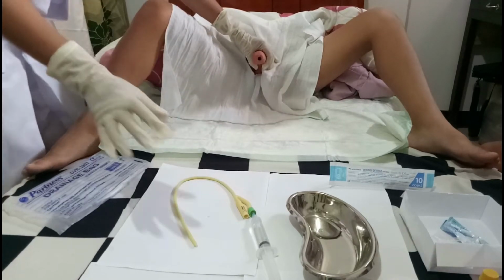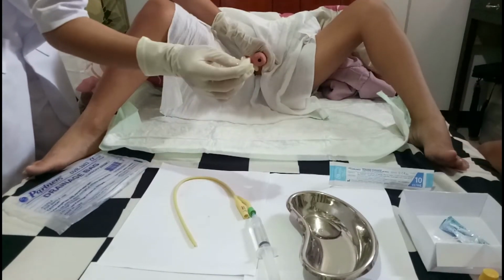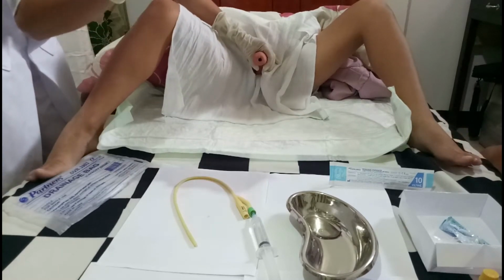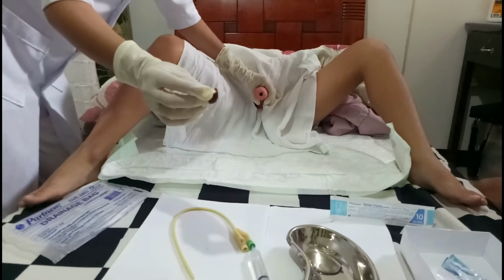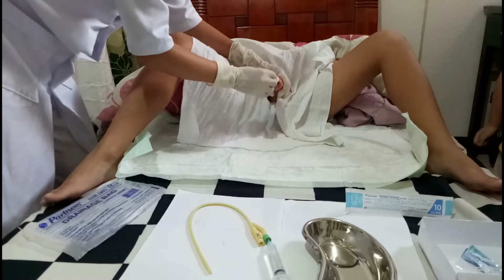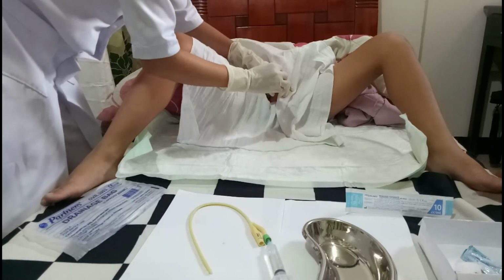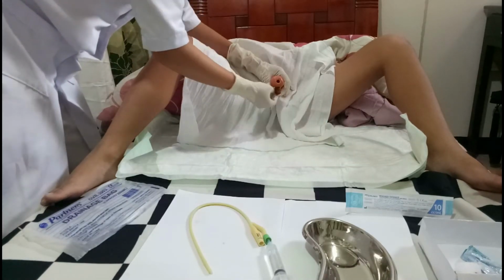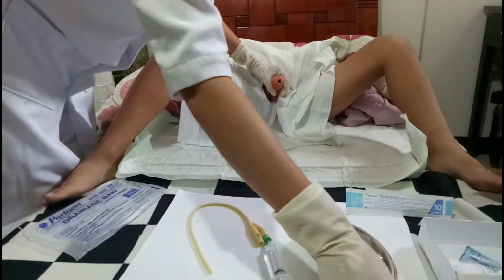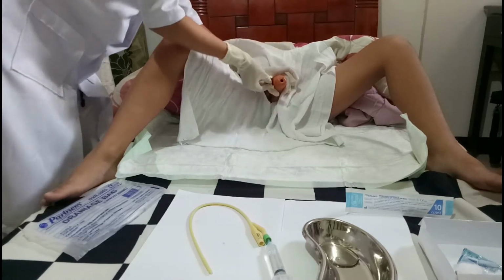So I'm just going to clean it now using my sterile dominant hand and with these cotton balls with betadine solution. So first I'm going to clean the inner to outer portion, then discard. Next, from inner to outer portion, then discard. Next, then discard. And now I'm going to lubricate the tip of the catheter.